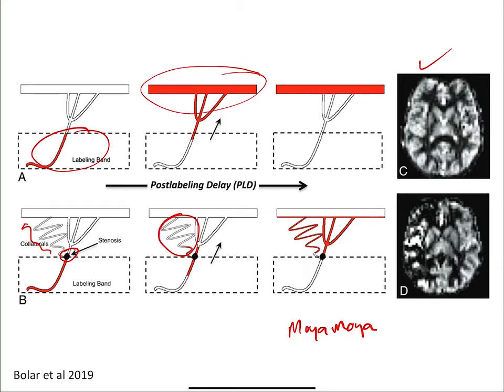So when you measure it, a lot of the blood is still on its way. It's either gone through this collateral flow, or it's moving very slowly because after it goes through the stenosis, its velocity is slowed down, and there's less blood flowing there. So you'll notice these big deficits where it's not that the blood flow is lower in those regions, it's just stuck in the supplying vessels.